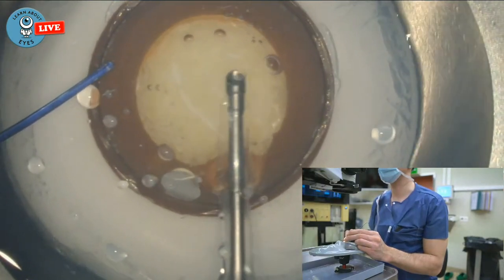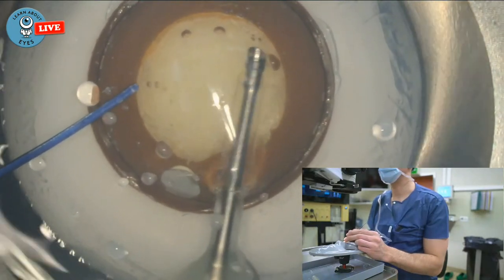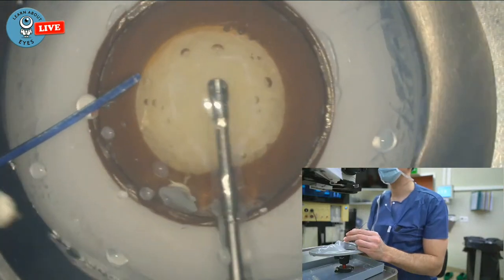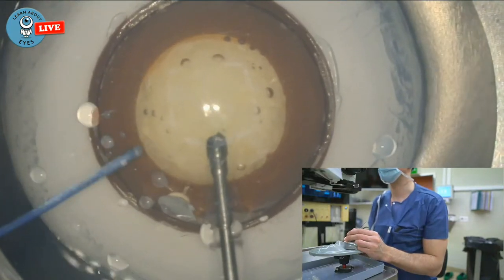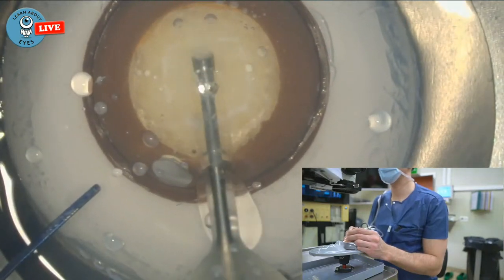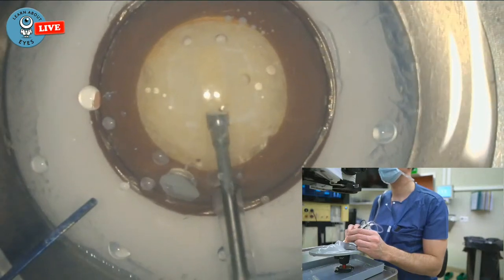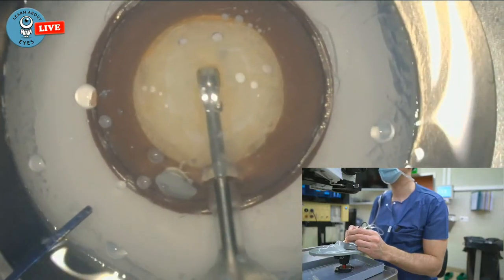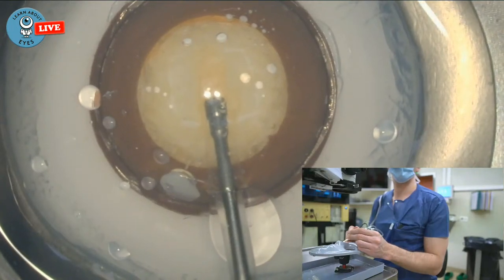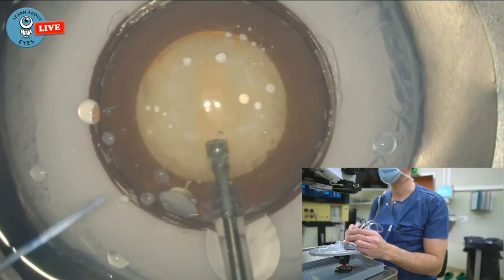Good thing is you can't destroy the cornea here. So I'm just trying to get, they're caught up here in this Visco that I put in before. But usually you get a lot of new ones very soon. So let's start with the first groove. If this sound from the Phaco machine is too loud or too annoying, just let me know. I'll just turn down the microphone for a while. So I'll get to that in a second.